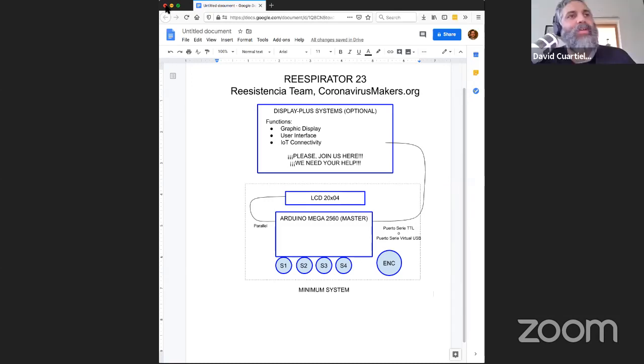First of all, I will start by taking the chat from Zoom, because people in Zoom have been very active and questions have not necessarily been copied to the list we have. So first, I was commenting just to make clear, because people were asking, that this is based on the Jackson Rees pump. So the question from Greg was, what does this use to create pressure? So it's basically Jackson Rees and you're pushing with that lever, right?